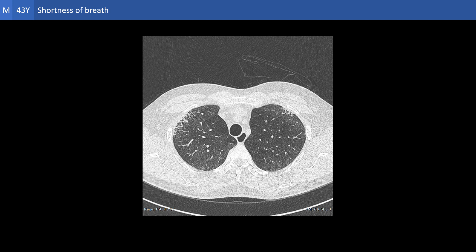The reticular pattern is simply the presence of abnormal lines forming a network at the lung periphery, entangling the two other patterns — the ground glassing and the honeycombing. Ground glassing is a higher attenuation value than normal, which nevertheless does not reach the level of consolidation. Honeycombing is the formation of small air cysts at the periphery of the lung.